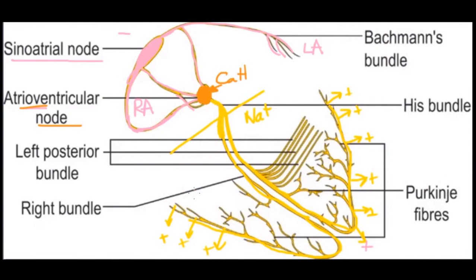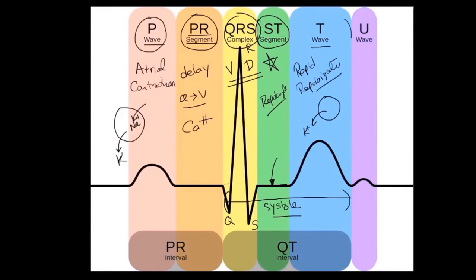And in terms of what we were talking about before, we've got the quick depolarization occurring through the sodium channels, and then you have repolarization of the entire myocardium afterwards. Now, as we just said, the period of systole spans all the way from the Q to the T. That brings up the issue of the QT interval, which is something that is seen quite often and which we'll talk about much more extensively later.